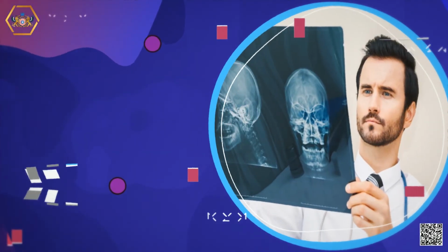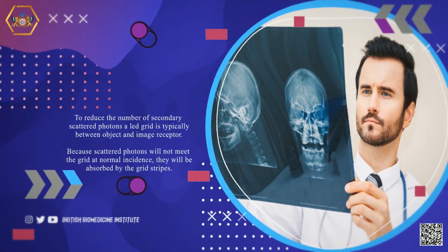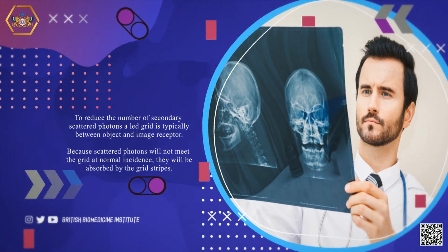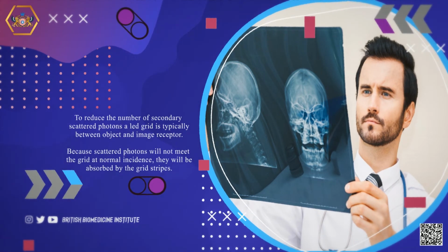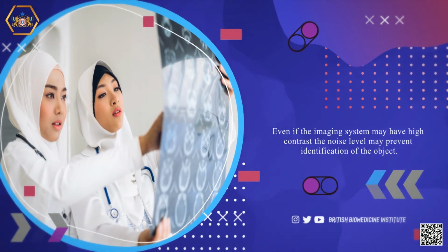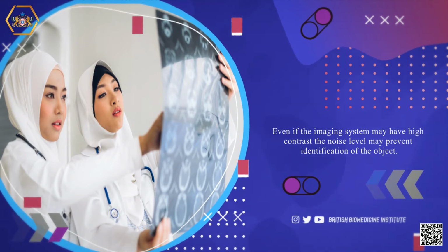To reduce the number of secondary scattered photons, a lead grid is typically placed between object and image receptor. Because scattered photons will not meet the grid at normal incidence, they will be absorbed by the grid stripes. Even if the imaging system may have high contrast, the noise level may prevent identification of the object.